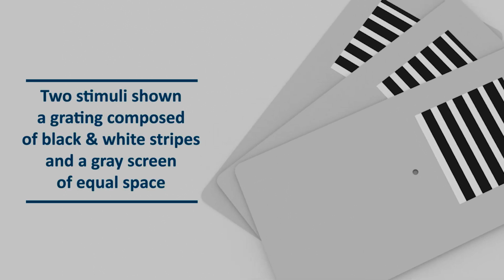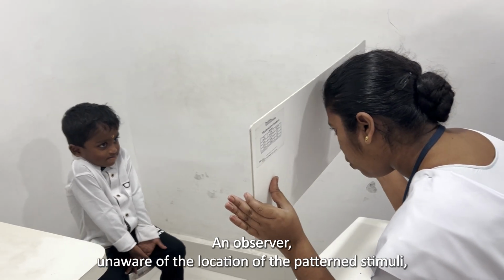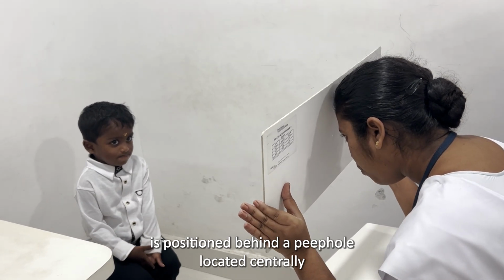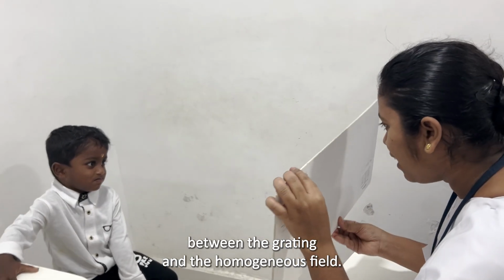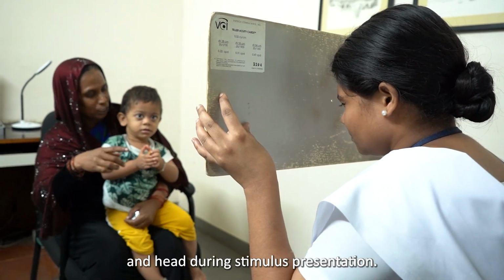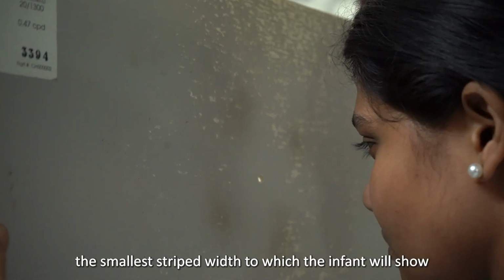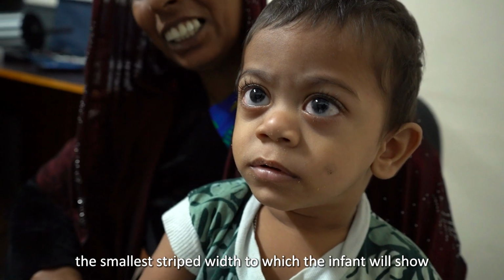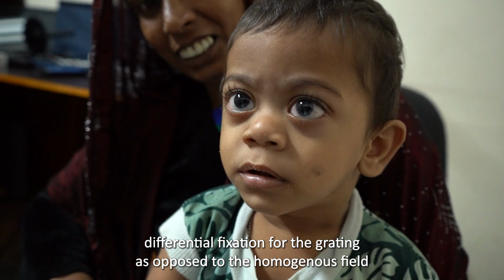Two stimuli are shown: a grating composed of black and white stripes and a grey screen of equal space with an average luminance. An observer, unaware of the location of the pattern stimuli, is positioned behind a peephole located centrally between the grating and the homogeneous field. The observer monitors the direction of the child's eyes and head during stimulus presentation. Acuity is estimated by determining the smallest striped width to which the infant will show differential fixation for the grating as opposed to the homogeneous field.